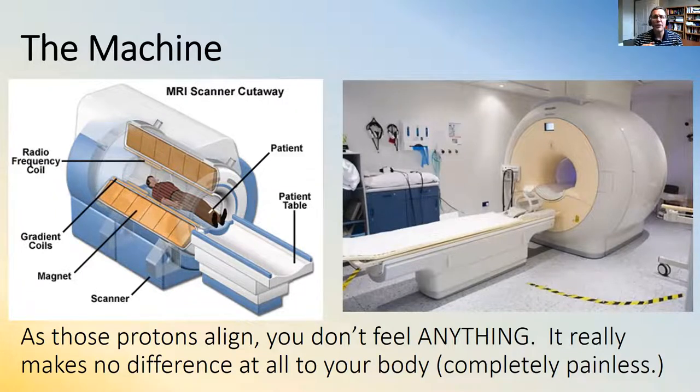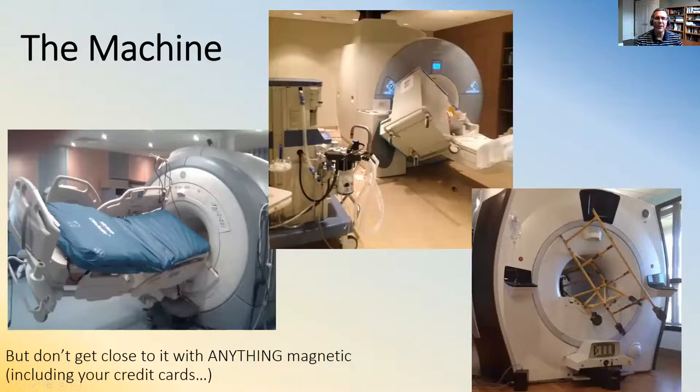When that happens, you don't feel anything. You really don't. You can't feel those protons doing that. It really makes no difference at all to your body whether they're lined up or not, which is really weird, but it's really true. It's completely painless. You won't ever feel anything of that happening. Why? Because they're so small. They're subatomic, the proton, actually. You cannot feel subatomic things. It's way smaller than anything going on inside your body. You will be completely unaware of it, and yet it's all happening, okay?